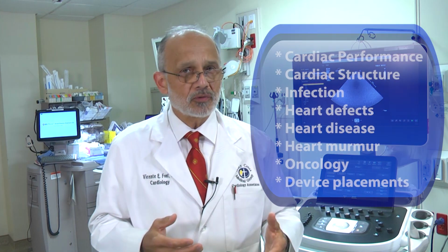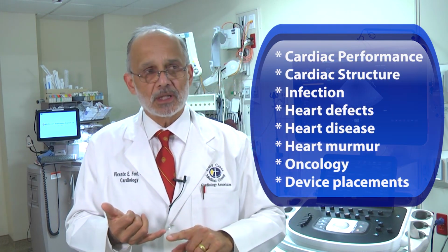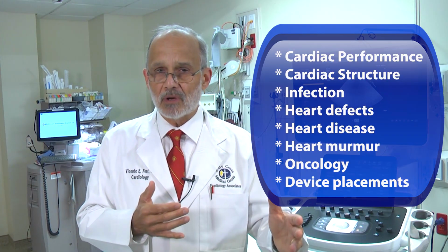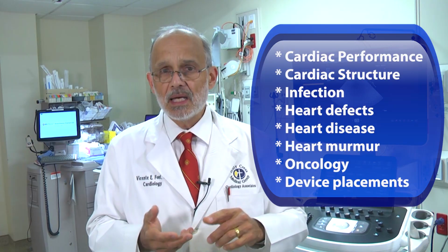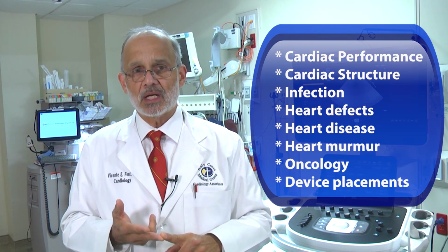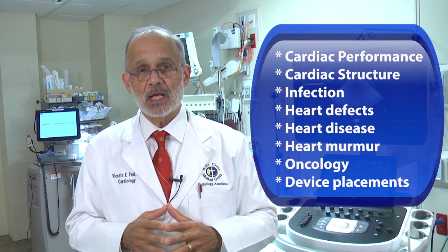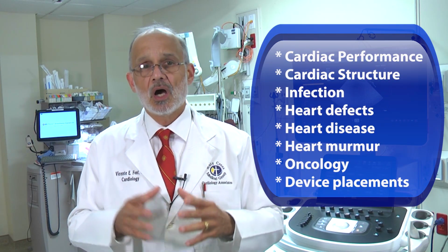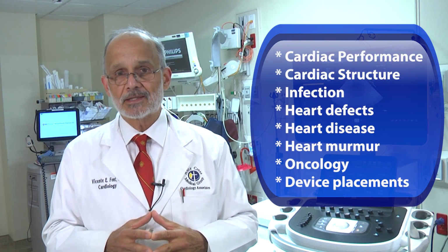So what is it useful for? Echo is very useful in the evaluation of many different things. It is very useful in cardiac performance, both at rest and with exercise, like I alluded to with stress echoes. Instrumental tests in the understanding of cardiac structure and function, and this includes better understanding of heart muscle pathology, heart valves, hemodynamics, which is the ability to measure pressures inside the heart.